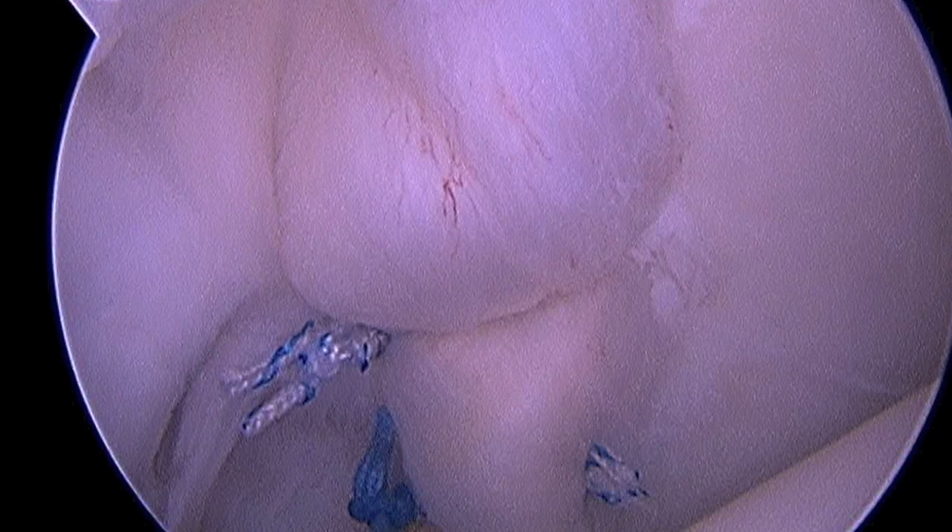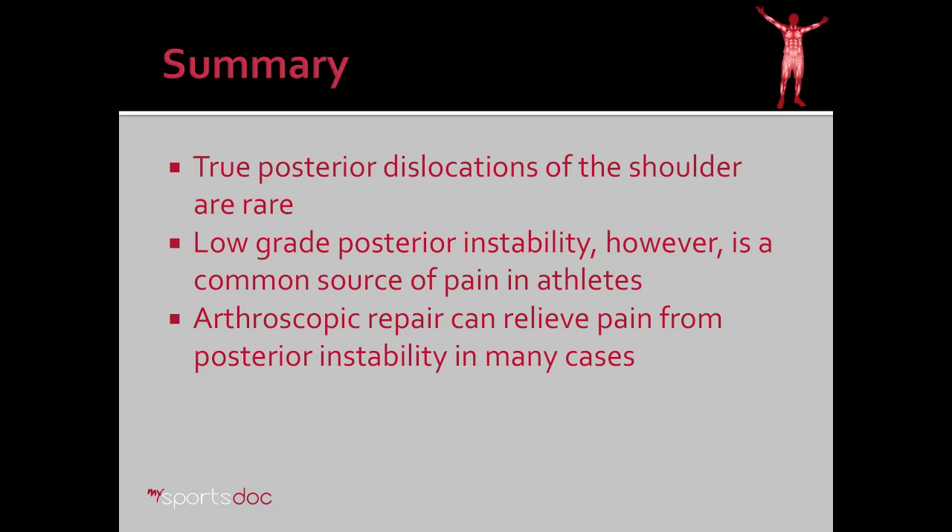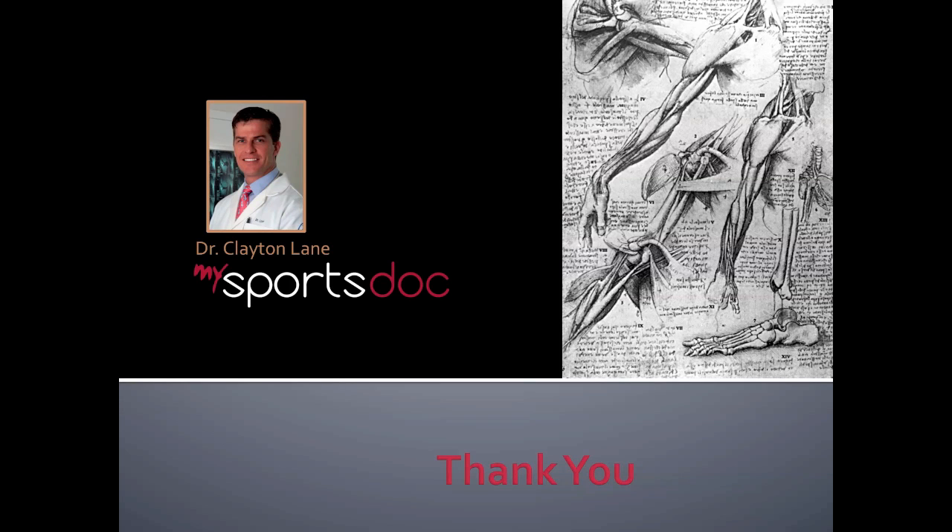And here you have the five-anchor repair of the posterior ligament and labral complex. In summary: true posterior dislocations of the shoulder are very rare. However, low-grade posterior instability is a common source of pain in athletes. Arthroscopic repair can relieve pain from posterior instability in many cases. Thank you.